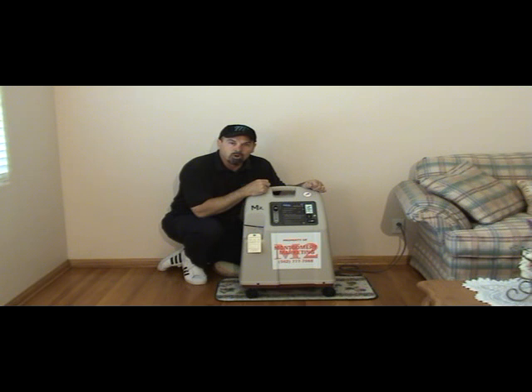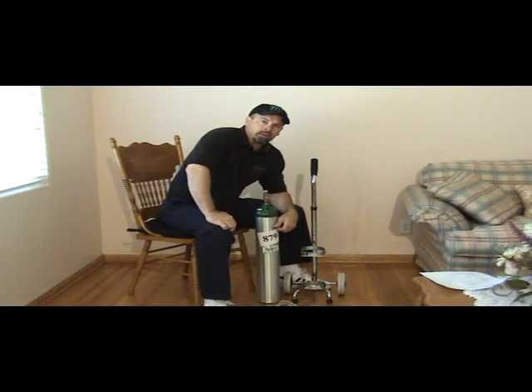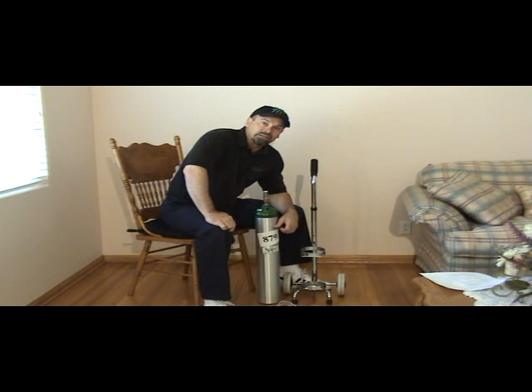Next, we're going to move on to the portable unit in case of power failure or in case you need to move around. When we deliver an oxygen concentrator to a house, it is an electrical device and it doesn't have a power backup. So one of the things we need to do is provide oxygen in case there's a power outage or in case a patient decides they want to go into the backyard or go down the street, something of that nature, if they want to remain mobile.